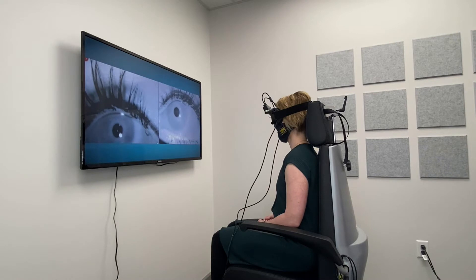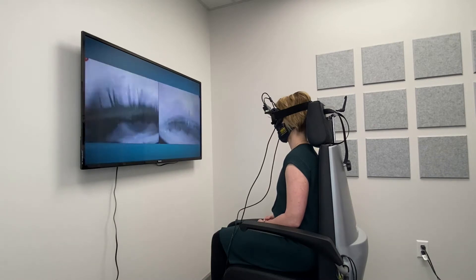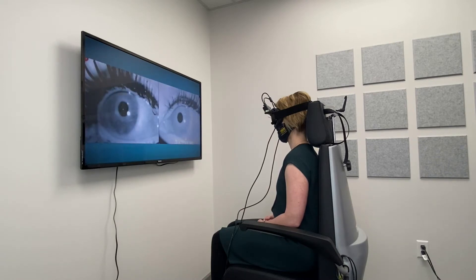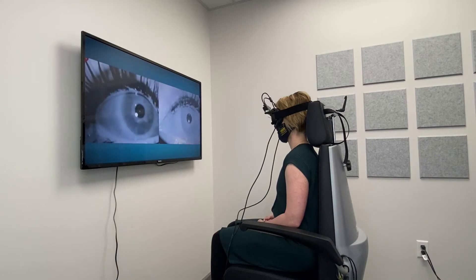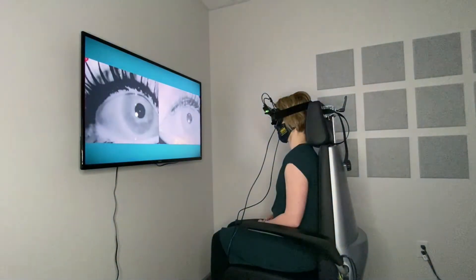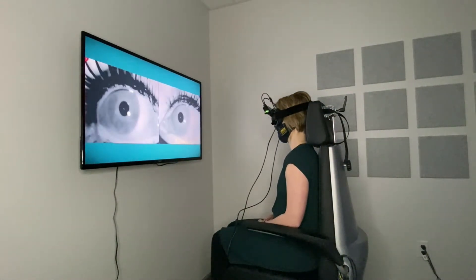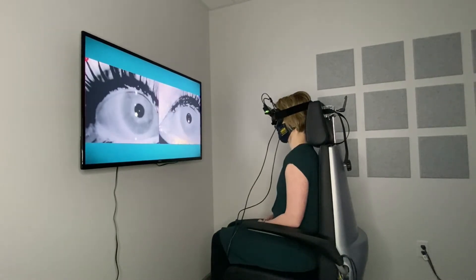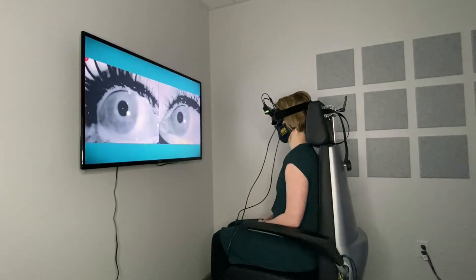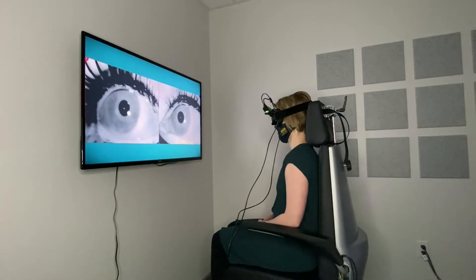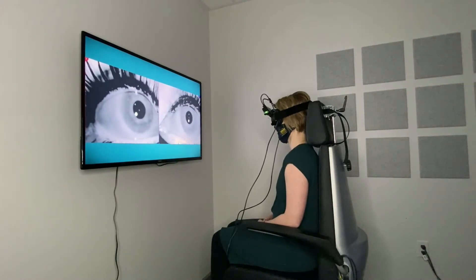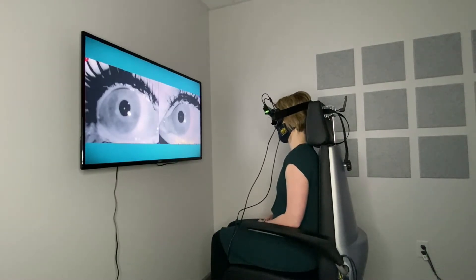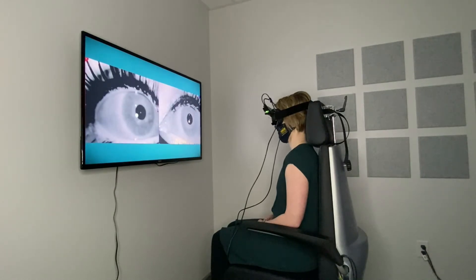Now we can get a really good look at Carly's eyes. This system isn't quite as sensitive as some, but we like to turn the lights out. In many cases, we like to have the patient remove any eye makeup that they might be wearing, because it just gives us a better look. But Carly's got nice big beautiful eyes there, so we can see her pupils really, really well. So then what we'll do is move on to the first step, which is calibration.